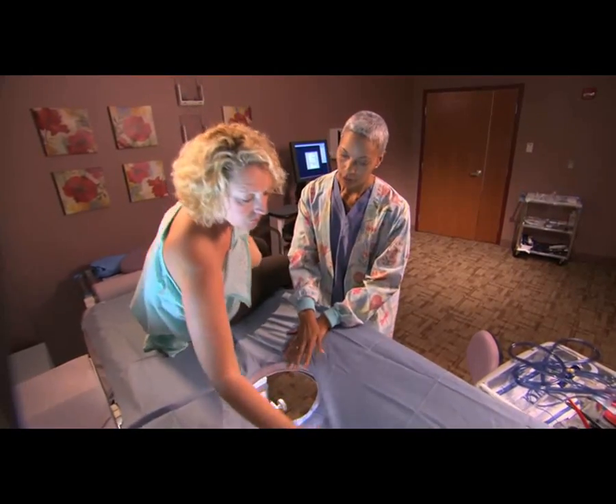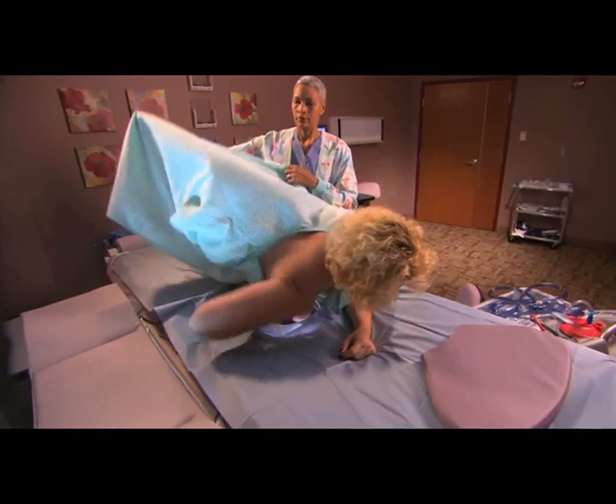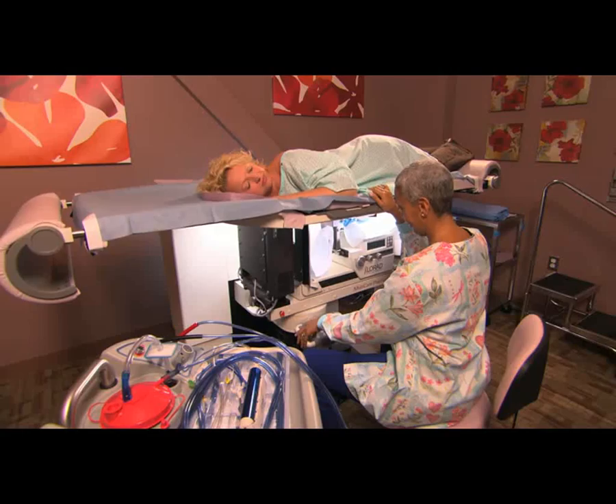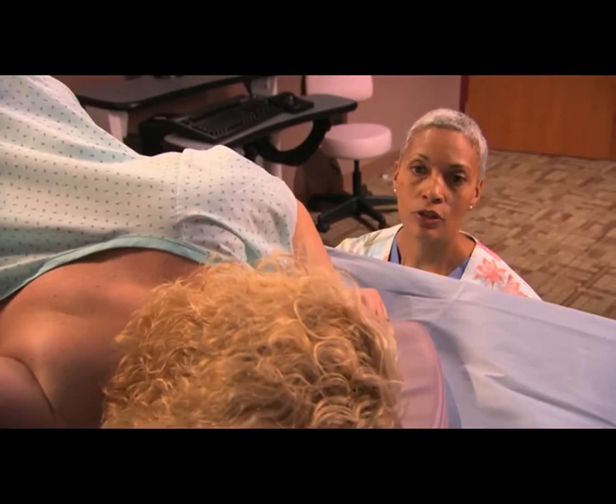First, you lie on your stomach on a special table with your breast through an opening. The table will be raised up and your breast will be carefully compressed into a fixed position, just like a mammogram.